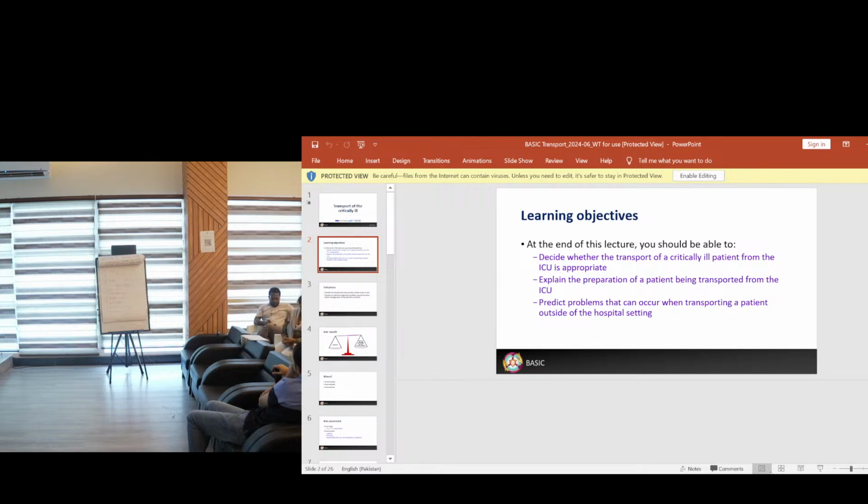So you go with the ventilator? Okay. So have you ever had that situation where the patient is intubated and you have to bag the patient to CT scan or something like that? Have you ever had that situation? The idea I'm bringing in is the bagging process. Because when the patient is connected to a ventilator, you set a PEEP, right? And then when you disconnect from the ventilator into your bag, this bag has to have a PEEP valve.